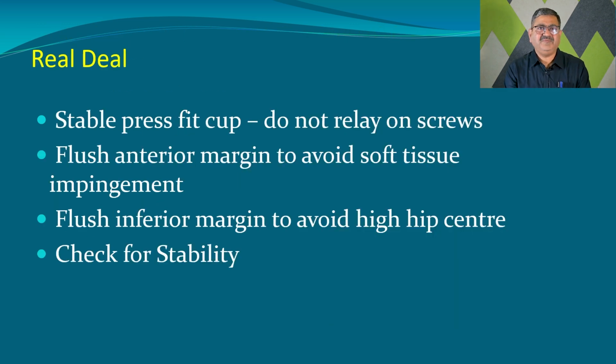For a stable press-fit cup, do not rely on screws. Flush the anterior margin to avoid soft tissue impingement. Flush the inferior margin to avoid a high hip center, and check the stability of the cup.